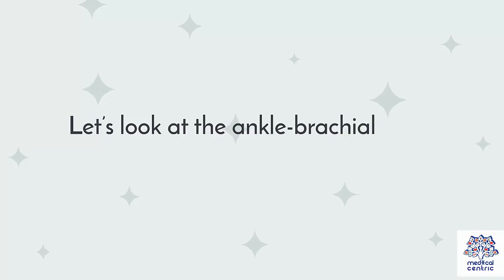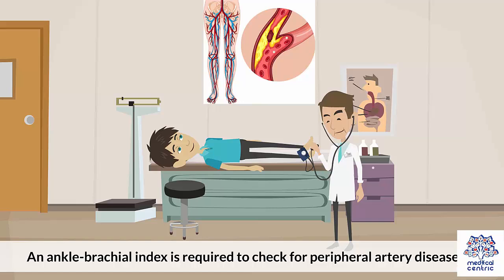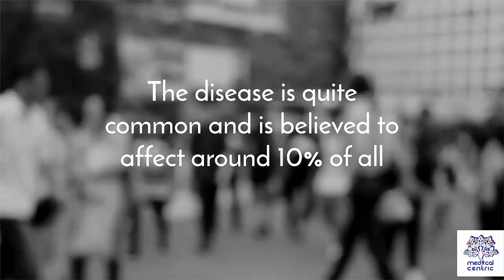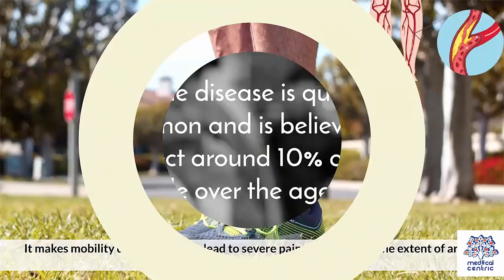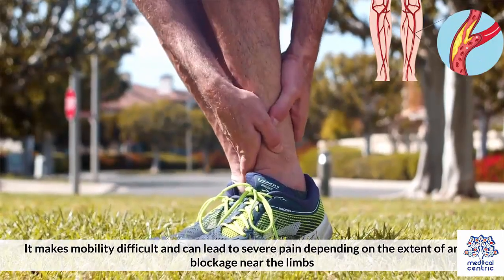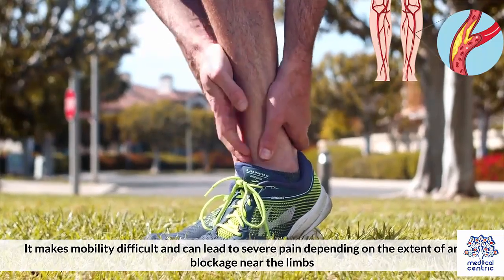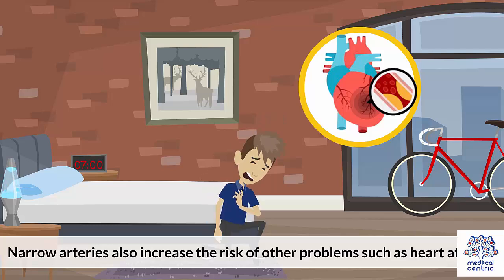Let's look at the ankle brachial index in detail. Why is it needed? An ankle brachial index is required to check for peripheral artery disease. The disease is quite common and believed to affect around 10% of all people over the age of 55. It makes mobility difficult and can lead to severe pain depending on the extent of artery blockage near the limbs. Narrow arteries also increase the risk of other problems such as heart attacks.